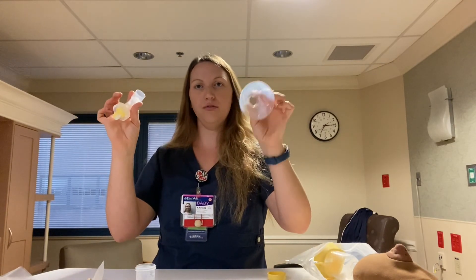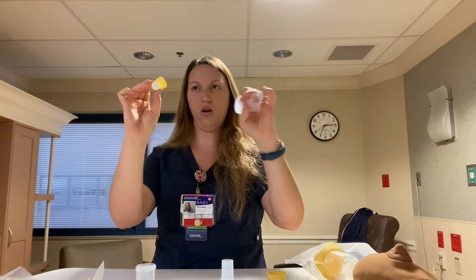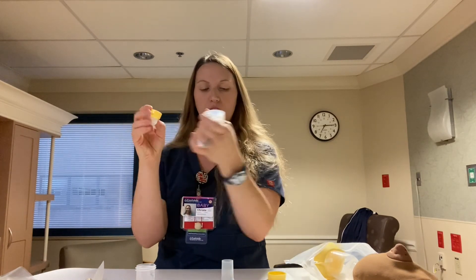Then take off the parts that need washing — wash, wash, and wash. Remember, that valve piece is two pieces in one. Just wash everything in warm soapy water and let it air dry, and it'll be good to go for the next time. Thank you!